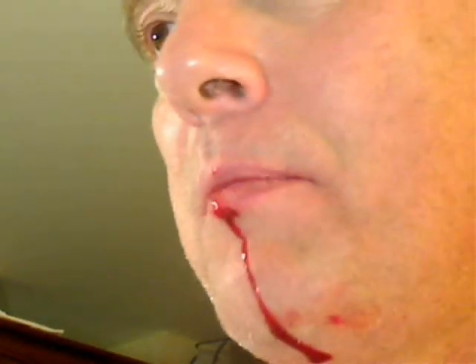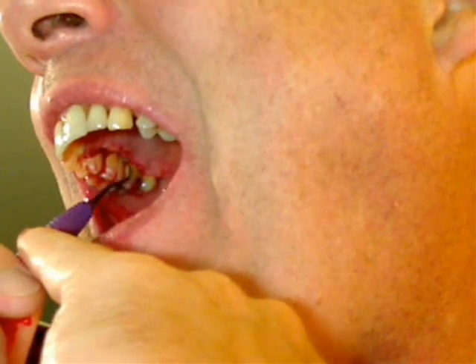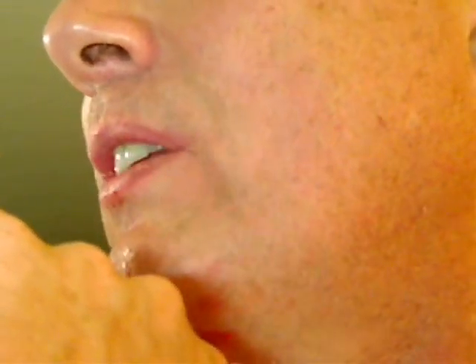That tooth is in some deep, deep doo-doo. If I could spend the whole nine, if I have to, just on that tooth — as a matter of fact, that's probably what I'm going to do — and then I have to hopefully not trash the nerve while I'm doing it.